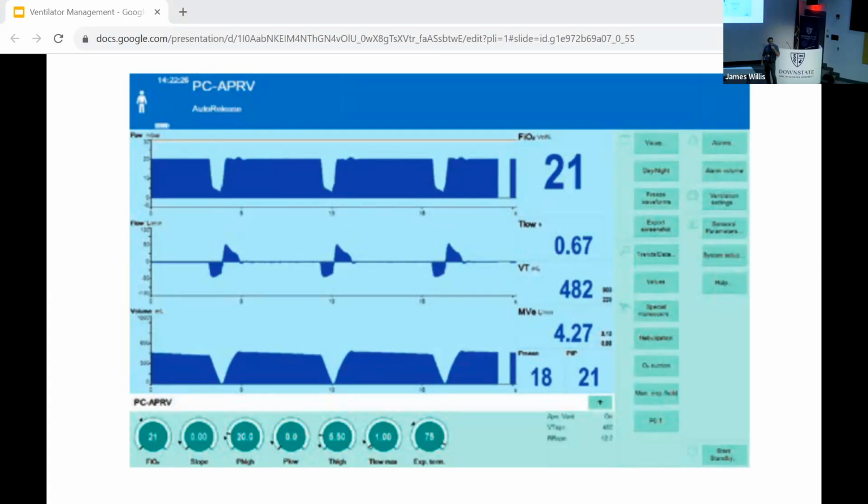Imagine being intubated with a central line in your neck, an arterial line in wherever it's placed, on ECMO. You have a fever and soft restraints. And you're banging the side, and there's a code next door, and the ventilator alarms are ringing, and you have an NG tube in your nose. Just think about that for a second. But that's what APRV is. It's supposed to be actually the more comfortable mode, believe it or not, to reduce the sedation requirements. But actually think about this stuff sometimes, and we'll simulate some of these ventilator breaths.